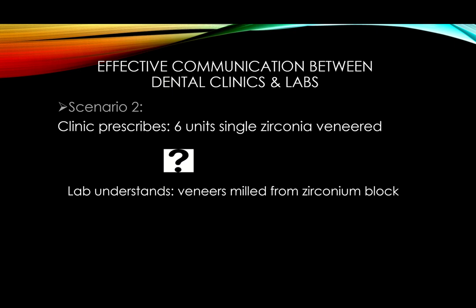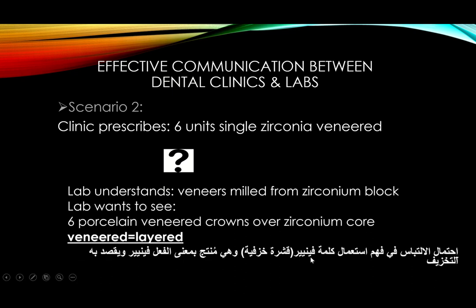Many people did and still think that they're unetchable and there's nothing that you can do to etch zirconia. And then there are new studies and new techniques for etching zirconia. We will discuss that in detail in its own section of this lecture. All right. So anyways, number 6, porcelain veneered crowns over a zirconium core.